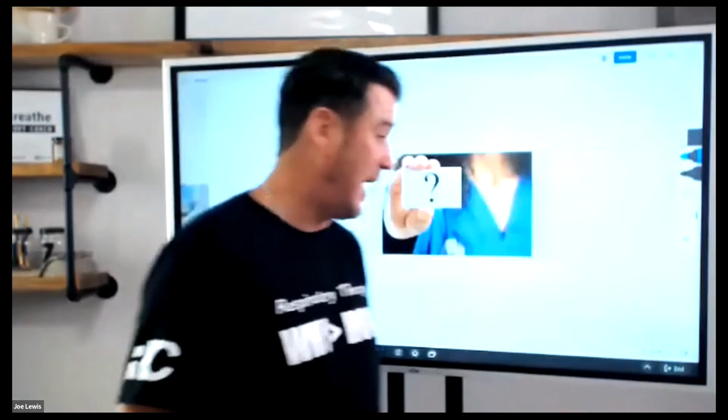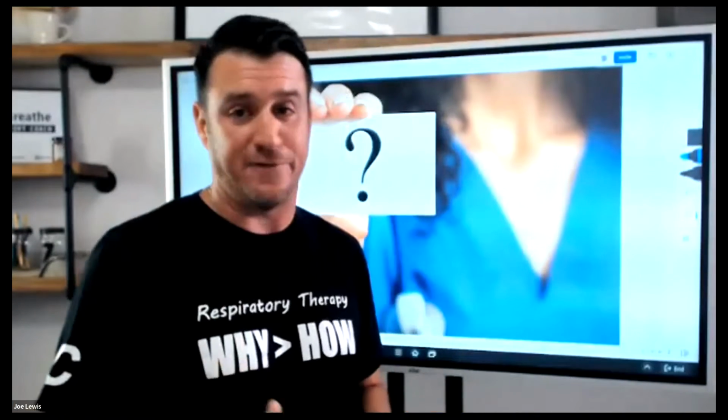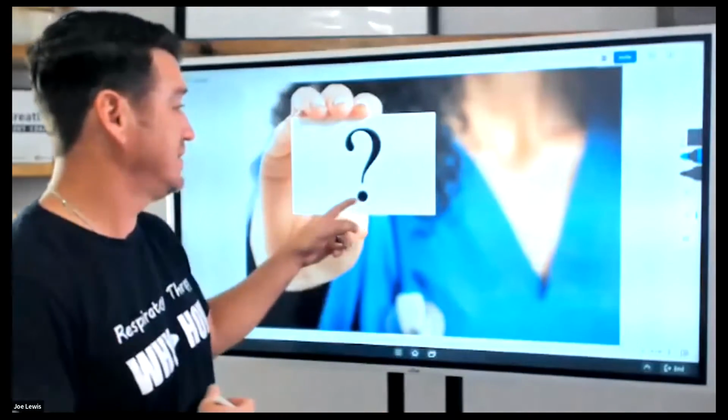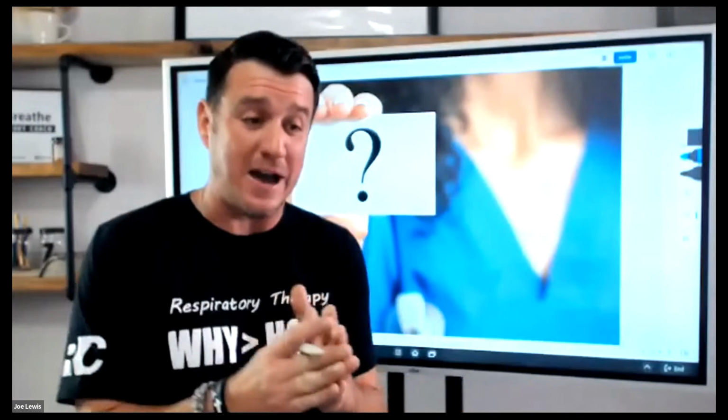But remember, we want to ask ourselves, are we adequately oxygenating our patient and weaning FiO2s appropriately to achieve that adequate oxygenation? Now, the third question you should be asking yourself. The first two are pretty simple, right? Everybody knows that: am I ventilating? Am I oxygenating my patients? Pretty clear, cut and dry, right? The next one is, am I protecting my patient's lungs?